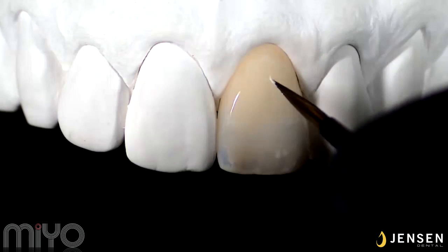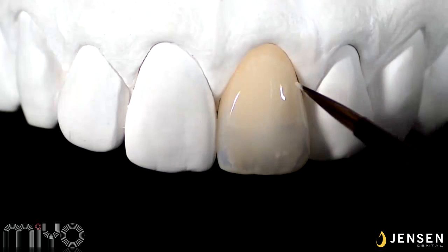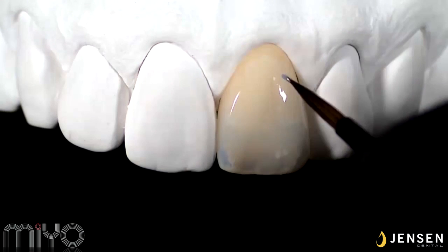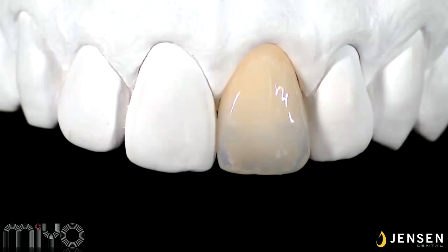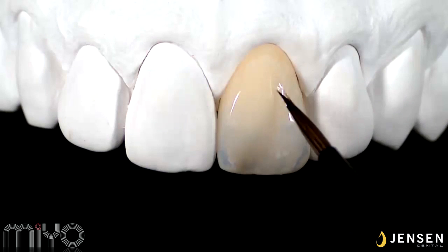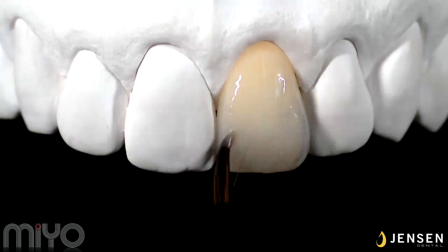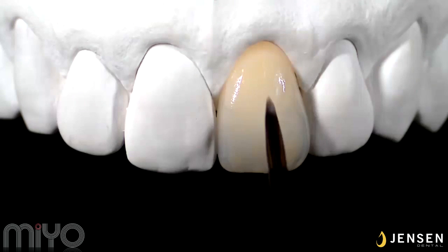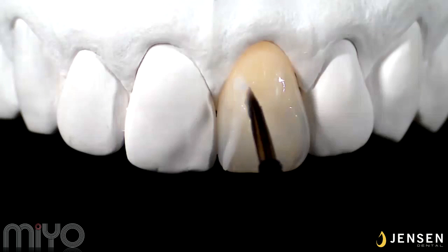Once all the colors and effects are applied, I will set the stains here and fire to prepare for my structure material to go on top. I like to fire about 60 to 100 degrees lower to shorten the firing cycle to simply set the colors. Before the actual structure application, a very thin layer of glaze liquid is applied before the structure to help the material flow and adapt to the surface better.